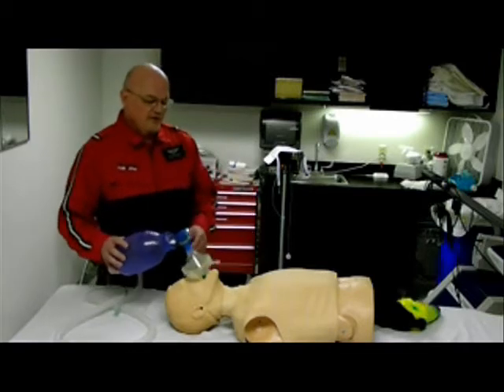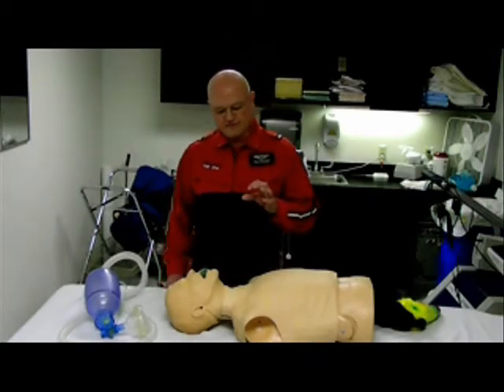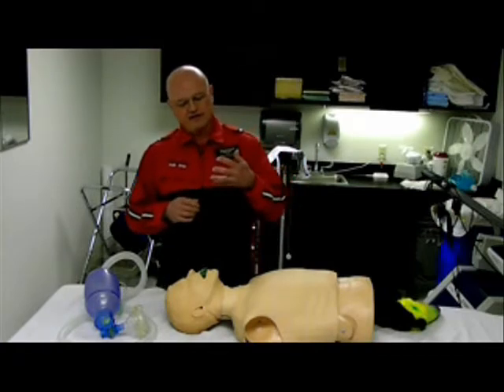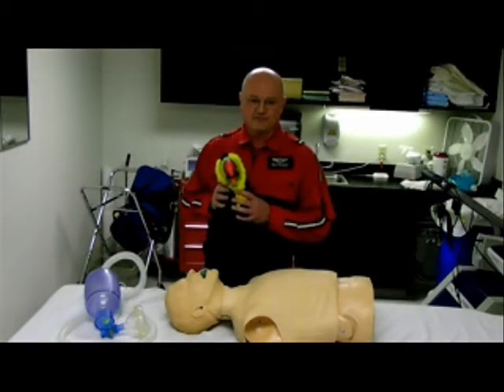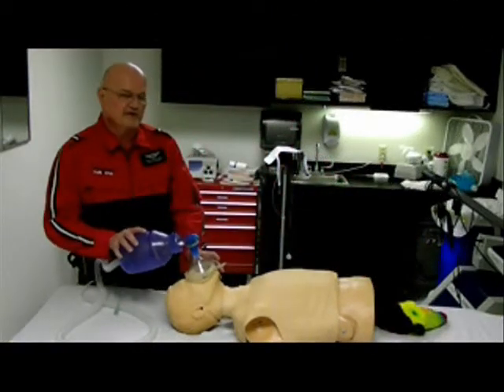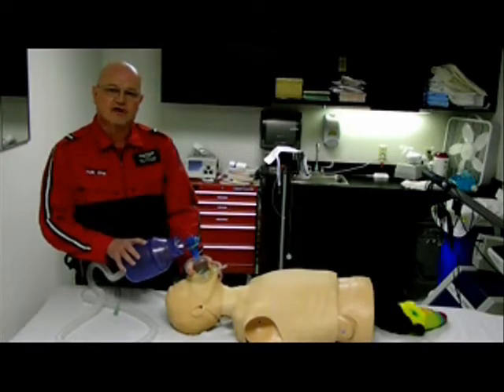Next, we want to put the mask on the patient. We want to use the CE method, where the C is formed by the thumb and the forefinger, and the E is formed by the little finger, the ring finger, and the middle finger — also known as the toucan finger, because toucan is a bird.